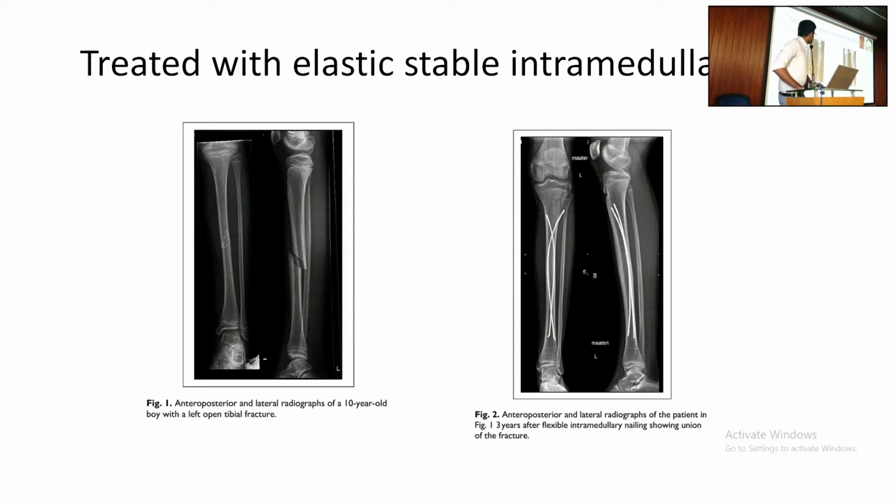Child is 10 years. Alignment is good. The 75% contact is okay, but you want to do the cross pin here. That will solve the problem. That also is not required. Too much for a 10 year old child; the gap is more in an older child. Even for a 7 year old, they will unite. That is in a child, not in adults.